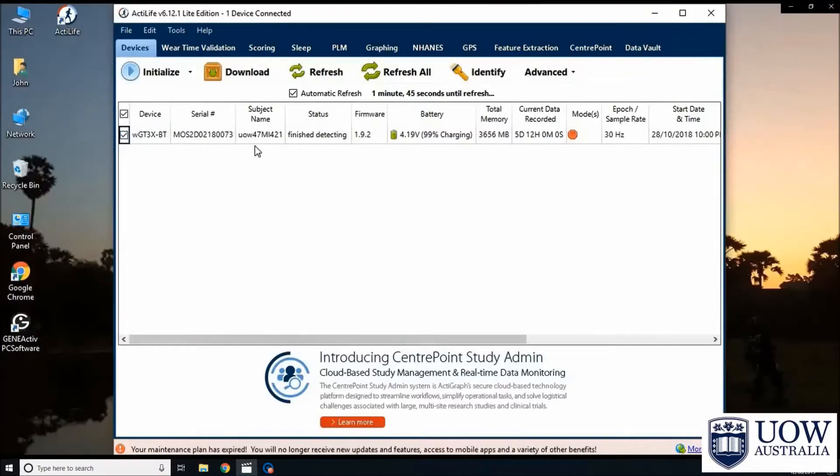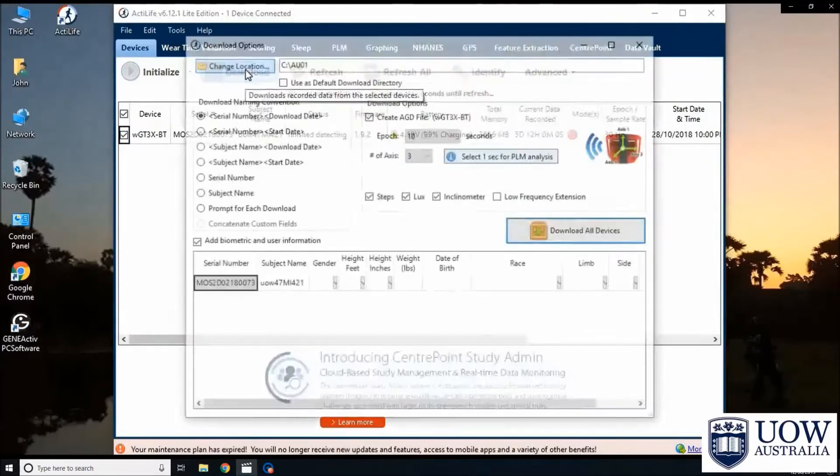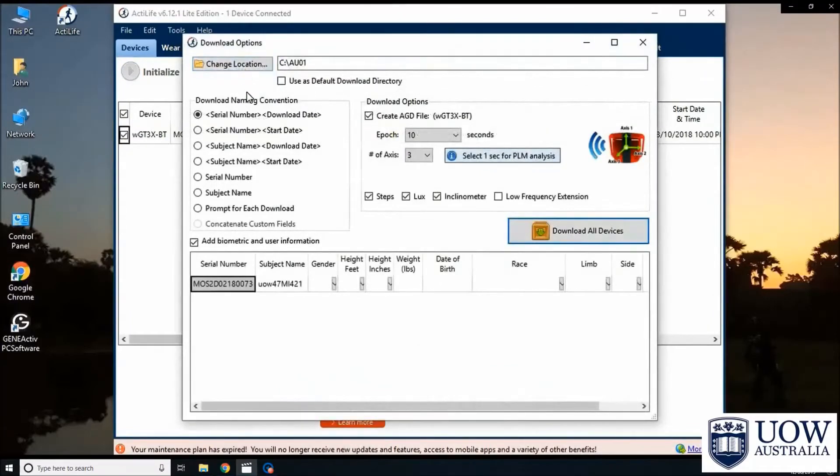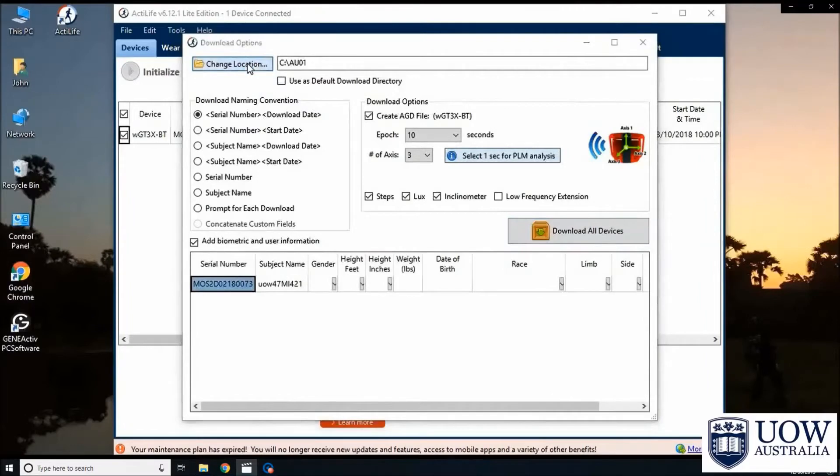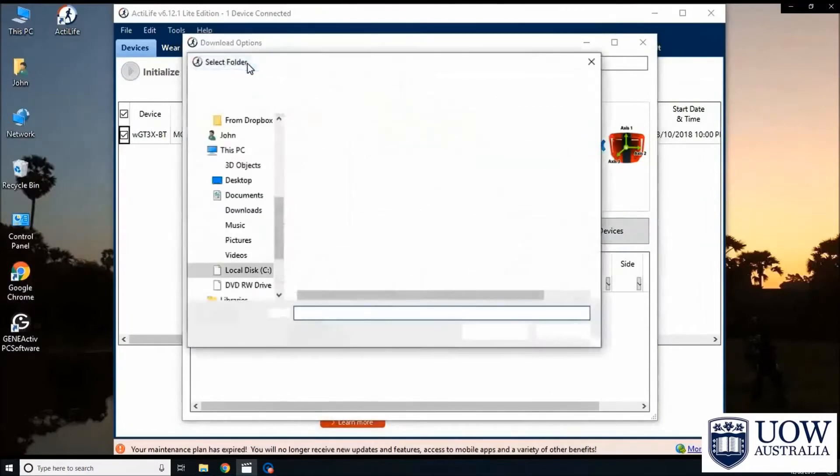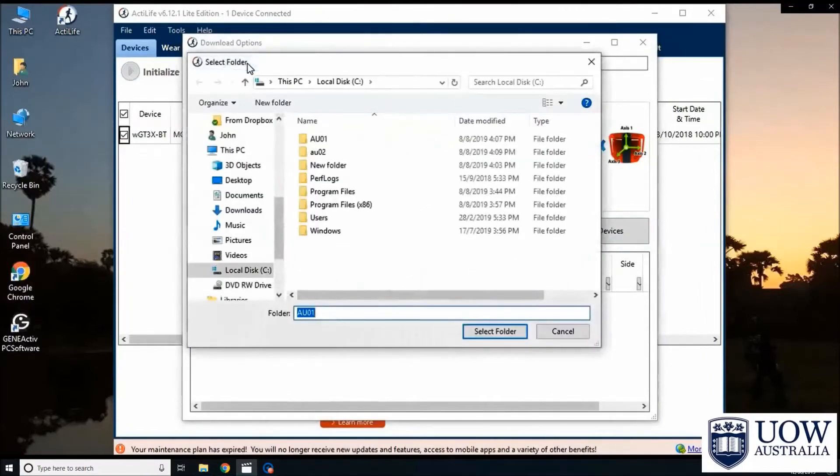Click on the download tab. This will open a new window. Click on the change location button to specify or create a new folder to save all the data files.